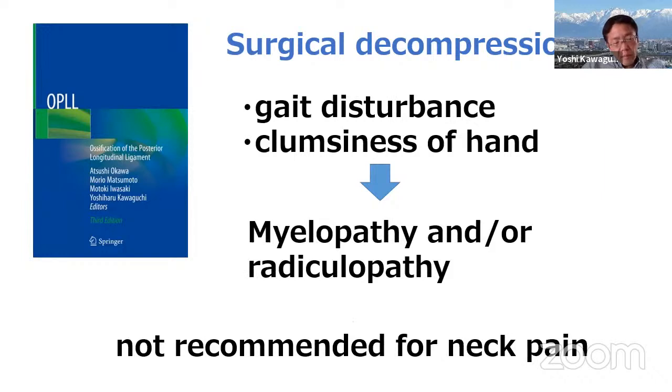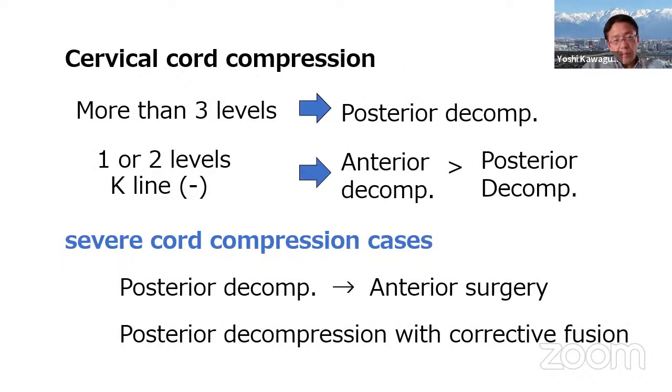I will briefly talk about anterior surgery for OPLL. The surgical indication is for myelopathy, not for neck pain. This is a surgical strategy for OPLL. In severe spinal cord compression cases, we perform posterior and anterior combined surgery.